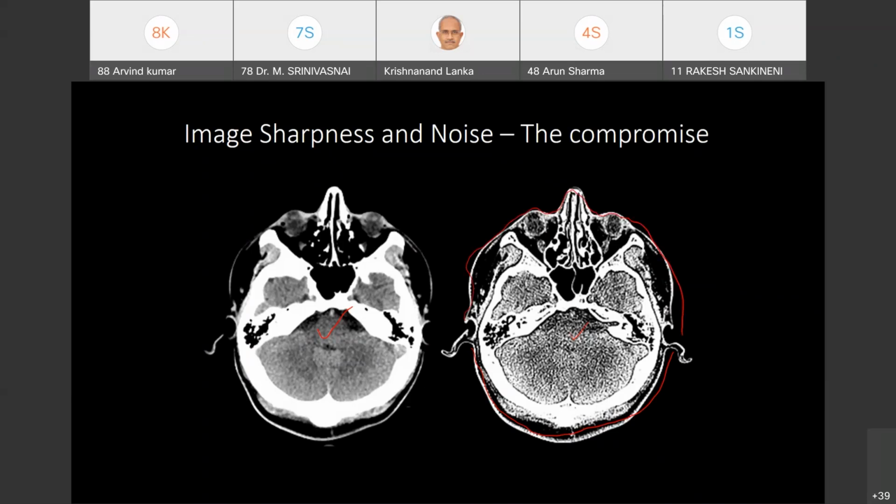Right? So that is how we have to choose the filters. What kind of filters? But anyway, fortunately, don't worry. All these steps are being done automatically. People are now using a lot of AI tools like machine learning and deep learning. In fact, about 90% of the work will be done by CT scanning machines. So don't worry, this is only to understand the underlying technology. Whatever I am saying here is only to know what is happening in the background.